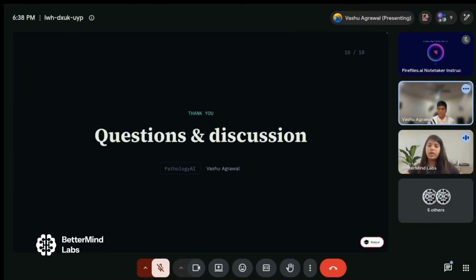Okay. One more thing that I noticed is that you had broken that bigger image into very small chunks. That was something really cool about this demonstration. On average, how many reports can be done using your tool in the current MVP stage, and later on, maybe 6 to 7 months from now, how many images do you feel can be processed on a day-to-day basis? All at once, or a user doing a lot of images through the day, in a span of 8 to 9 hours, a whole working session?